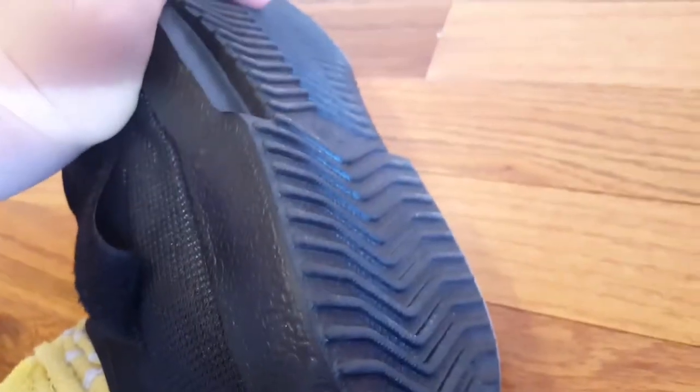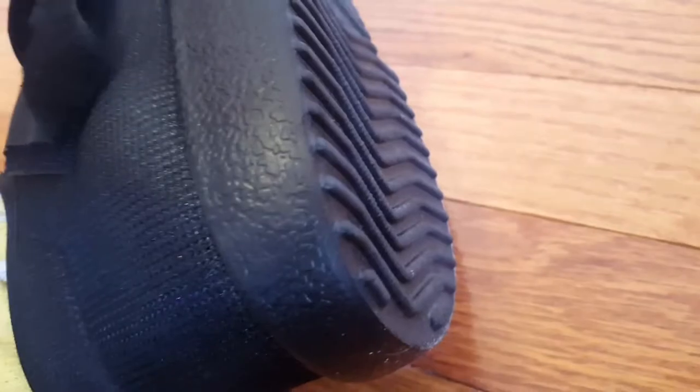There are ridges on the bottom that are supposed to help with slipperiness and add some grip. However, I still skid. I have almost fallen a few times, so keep in mind that the grip doesn't necessarily work that well, even though it looks like it would. It is still quite slippery.